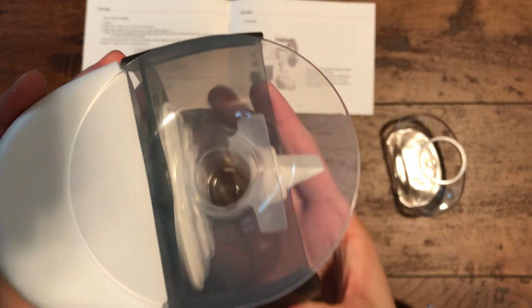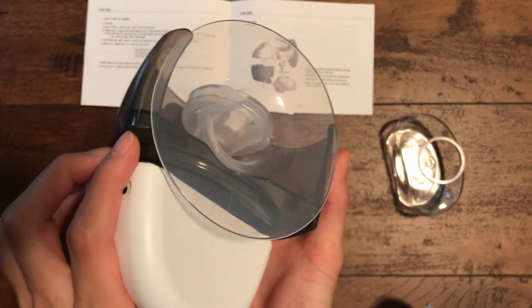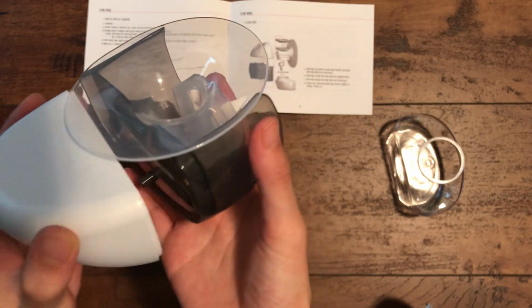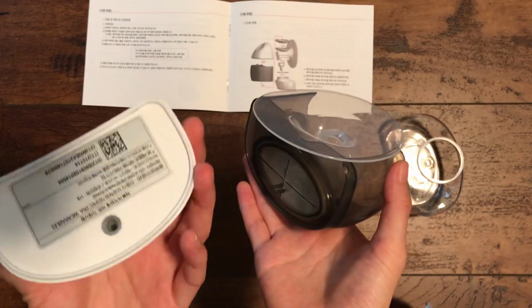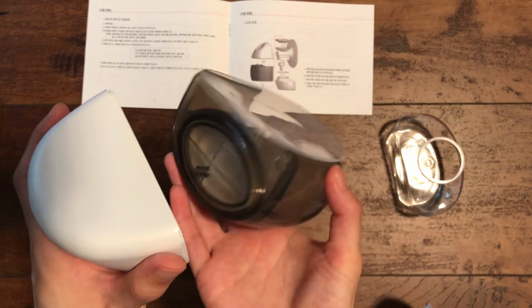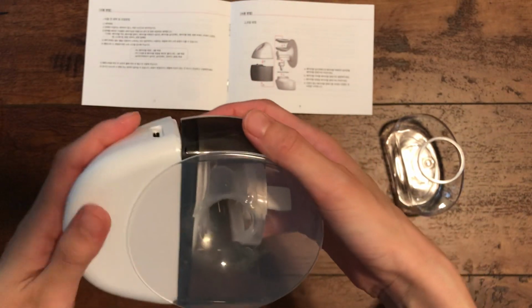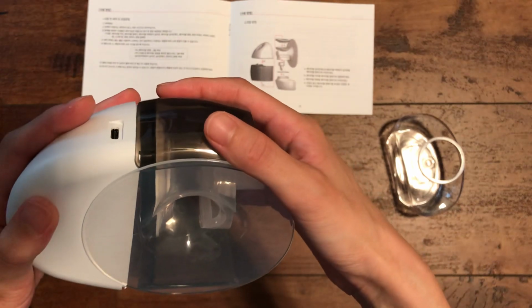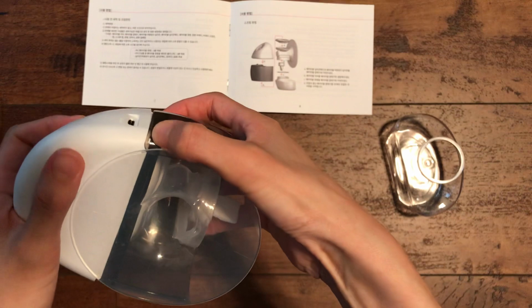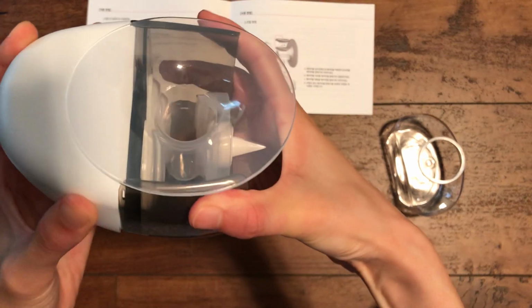The main reason is because these are held together by these tiny holes. So there's one hole here and then another hole here. So it's a little bit tricky to manipulate, and this thing is quite heavy. This is very heavy. I mean, compared to this, it's not terribly heavy, but compared to this, it is. So what I found to be easy was I go ahead and click in the pump into both holes. So one here, and then you can click in one here.